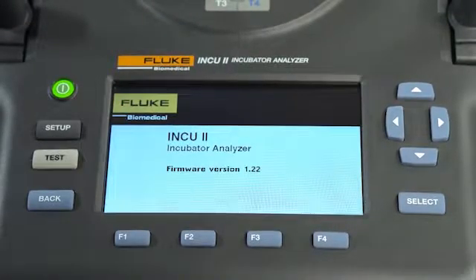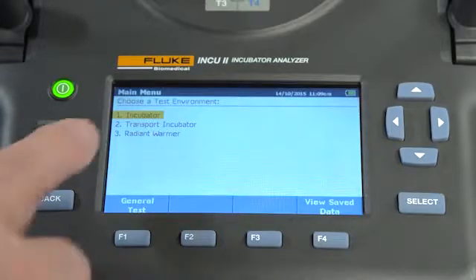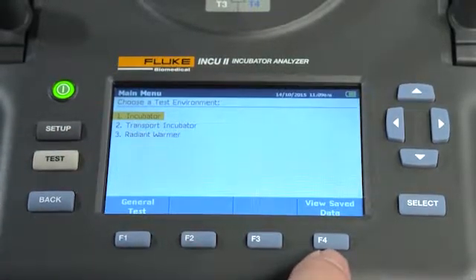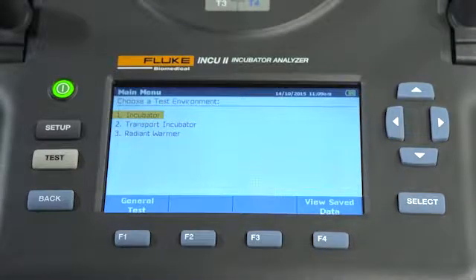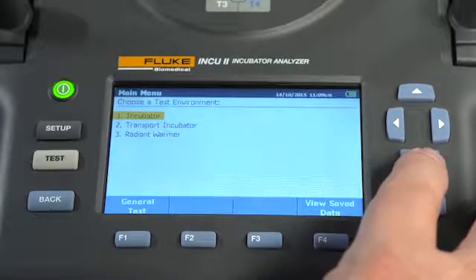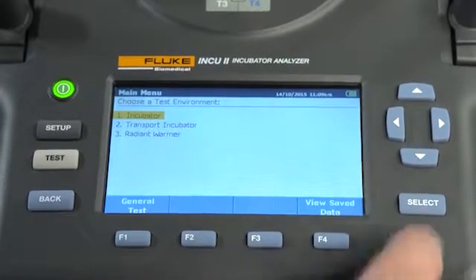When it's ready to test, the main menu will appear. Select a test environment and choose a general test or view saved tests. For example, if you're going to run an incubator test, highlight incubator from the test environment option using the navigational arrow keys and then press select.